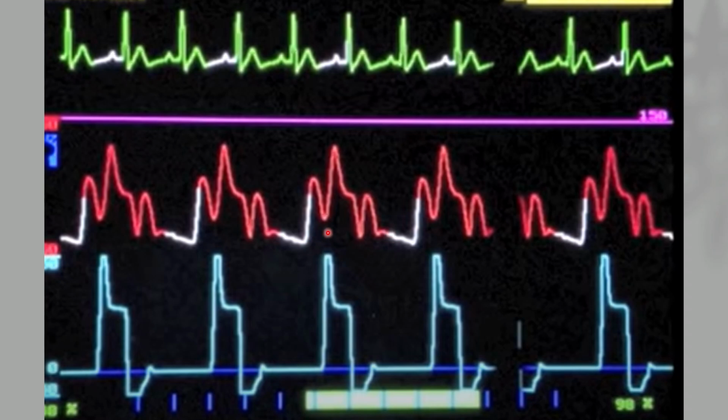The patient now has a MAP of 75, good urine output, and the tachycardia is slightly reduced from before. We now take an ABG and see normal lactate and improved oxygenation, and SvO2, central venous oxygen saturation, is normal, and the patient markedly improved.